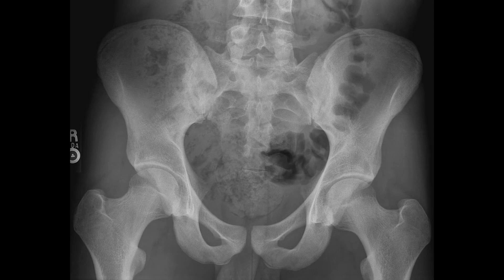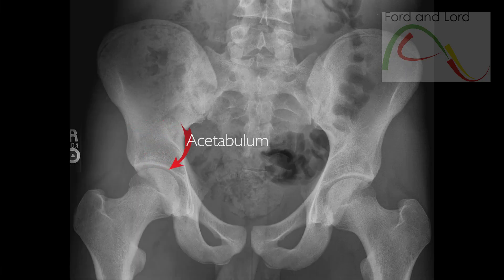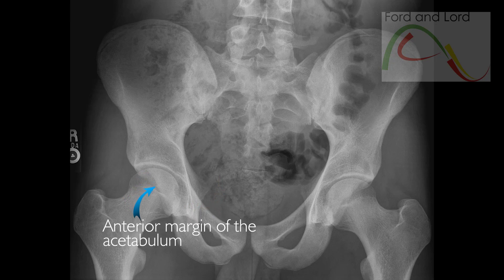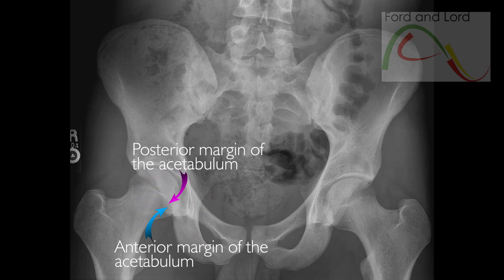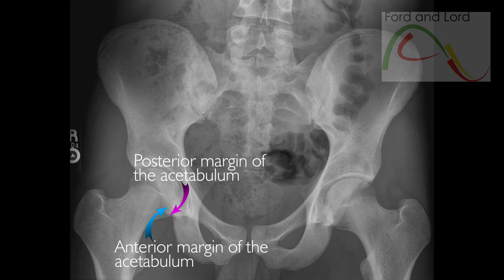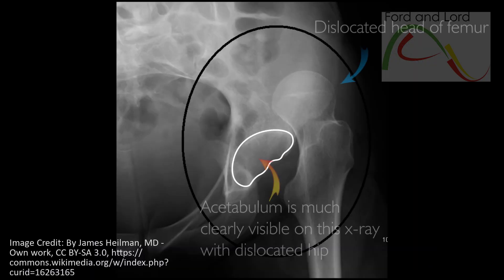Some parts of the acetabulum that were discussed in the last video can actually be seen on plain x-rays. This whole semicircular structure is the acetabulum, and these are the anterior and posterior margins of the acetabulum. Remember, the acetabulum is a cup-shaped three-dimensional structure, but the structures are superimposed on plain x-rays.